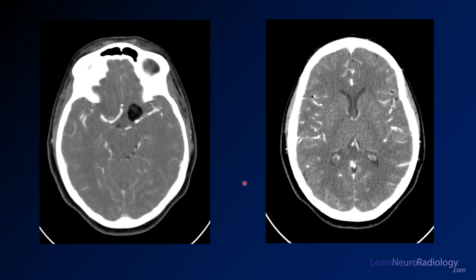You probably suspect it contains fat, but you want to confirm that — and you're able to confirm it with this CT. The lesion clearly has fat density, similar to subcutaneous fat. This also makes it easier to see the ruptured globules of fat — one there, some near the quadrigeminal plate, as well as in the bilateral sylvian fissures. These are the quintessential findings of a ruptured dermoid.